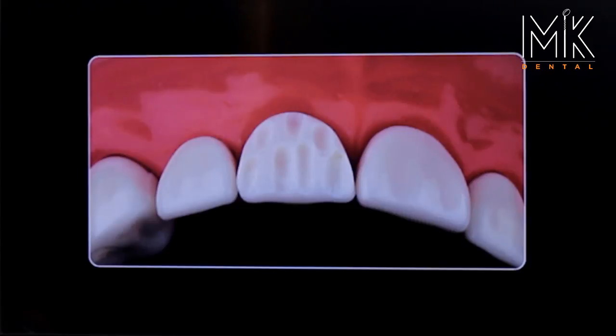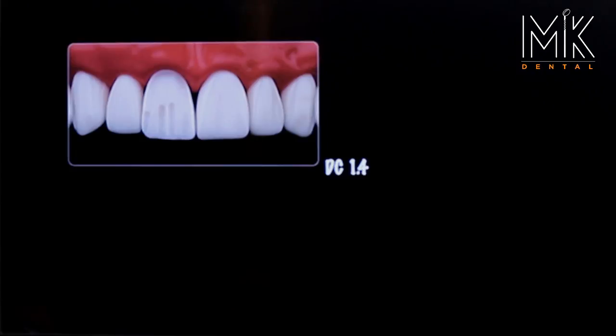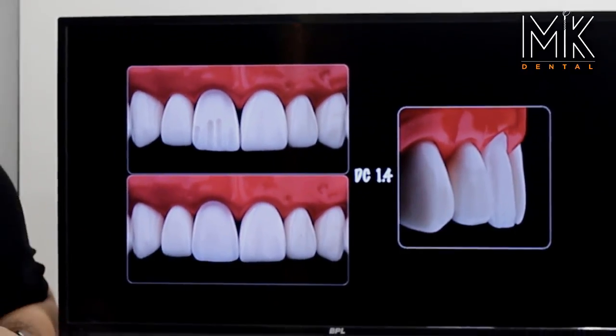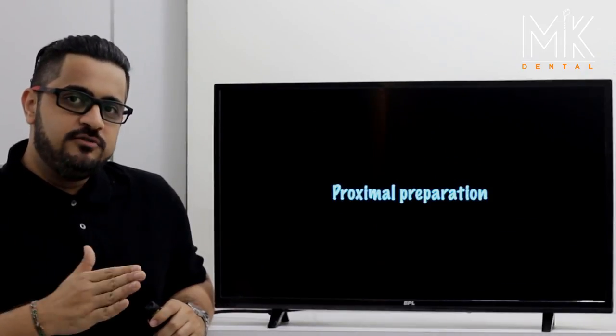Once you have achieved these grooves, you go ahead and reduce plane one only with the exact same burr. As you can clearly see, the plane two grooves have not been touched at all — this makes sure your burr angle is correct. Now you straighten your burr and remove the islands in plane two. This gives you uniform reduction in plane one and plane two of exactly 0.7 millimeters. With this, we complete the labial aspect of the preparation.